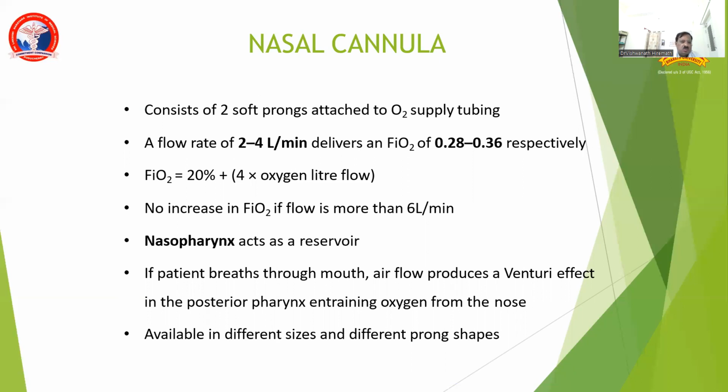More than 6 liters will not achieve any benefit because the humidification of the inspired air is lost, and it will cause more harm.